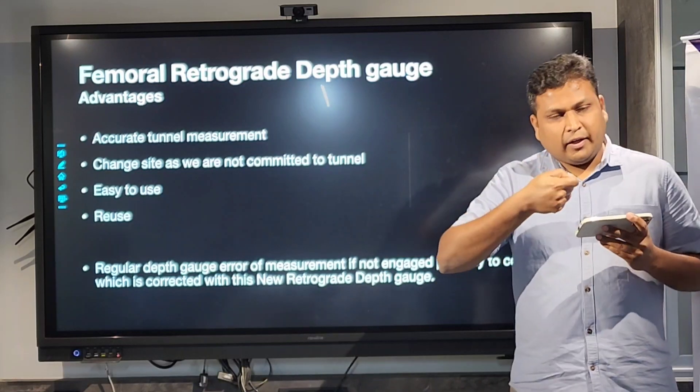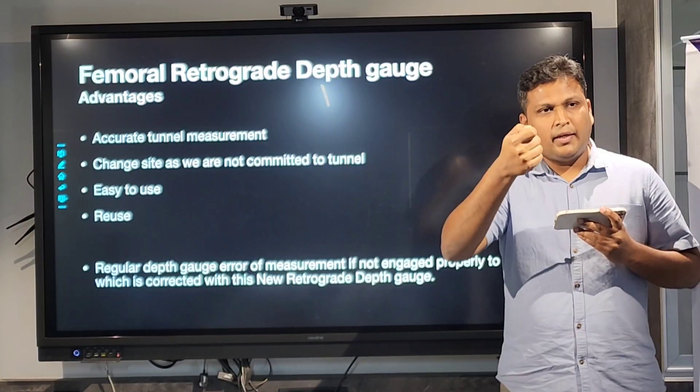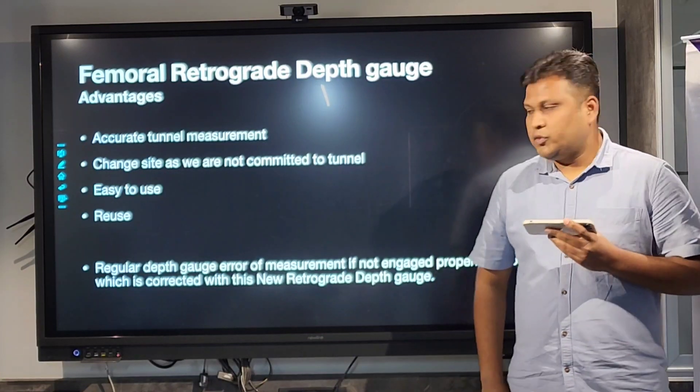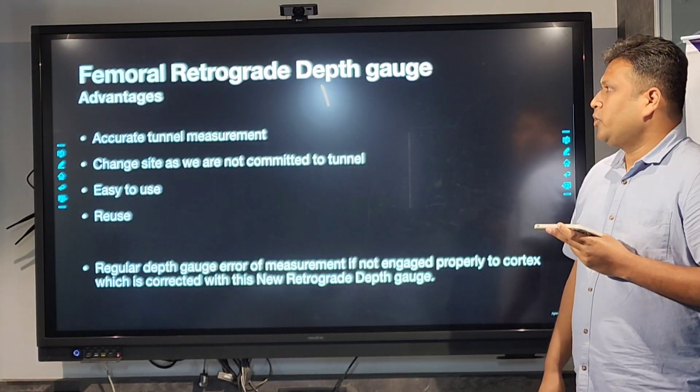With the regular depth gauge, if it goes beyond the outer cortex, or if it is abutting somewhere in the tunnel, or goes beyond the outer cortex, you might get a difference in the tunnel length measurement. So this is far more advantageous than the regular depth gauge.